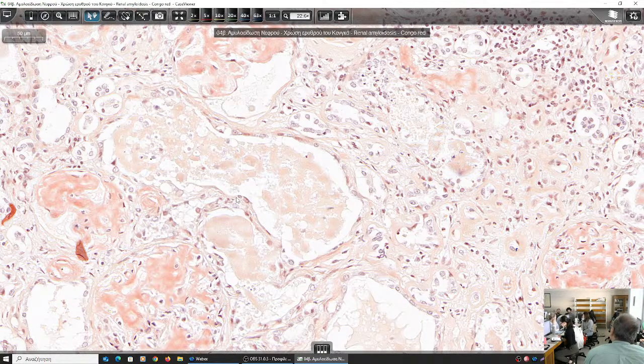Since here we are talking about a tubule, wouldn't it be coagulative necrosis? If there is some sort of abrupt obstruction of an artery, we have a pale infarct. That means coagulative necrosis. However, this is not the case here, because there is a gradual decrease in the blood flow from the glomerulus to the tubules. So this is amyloidosis. Let me summarize.